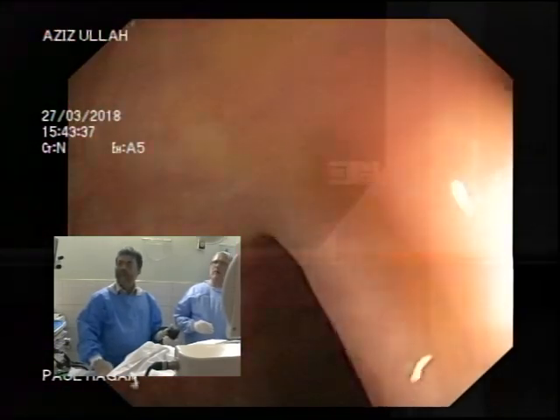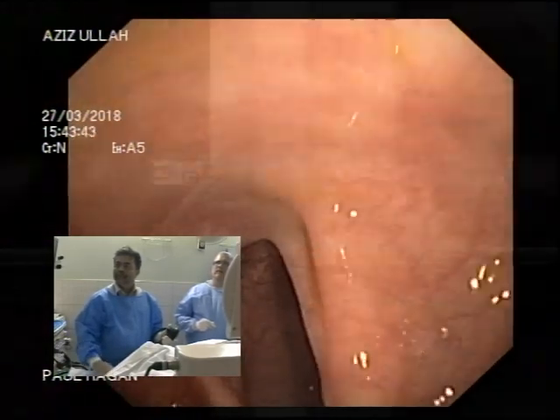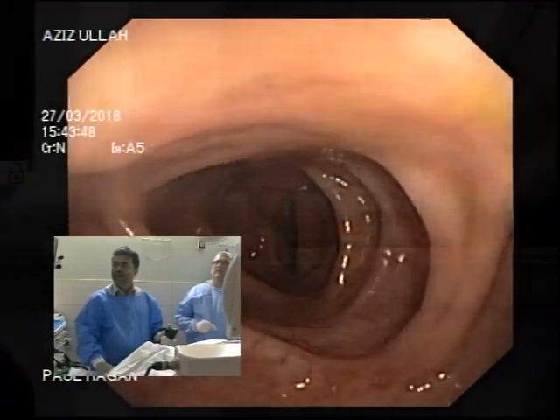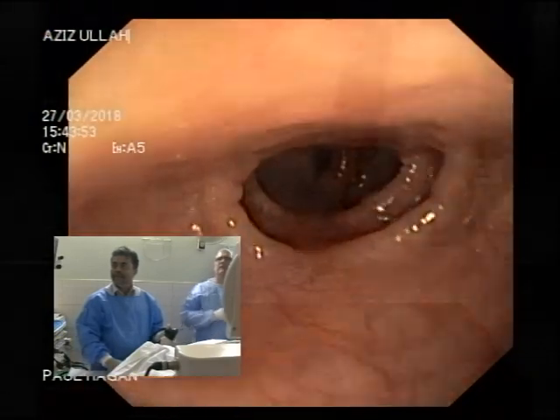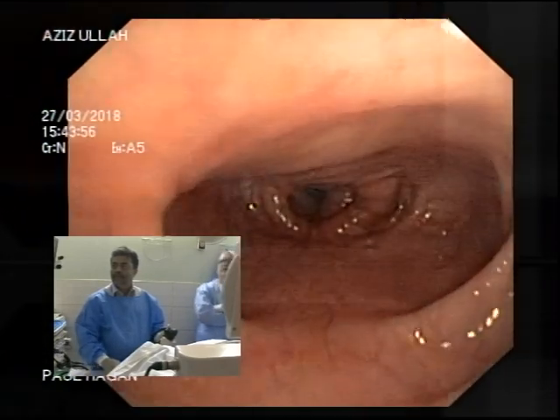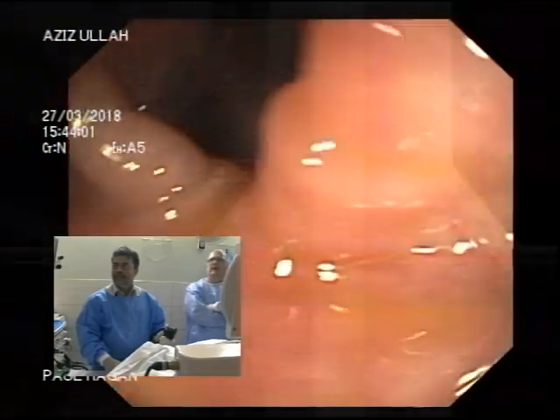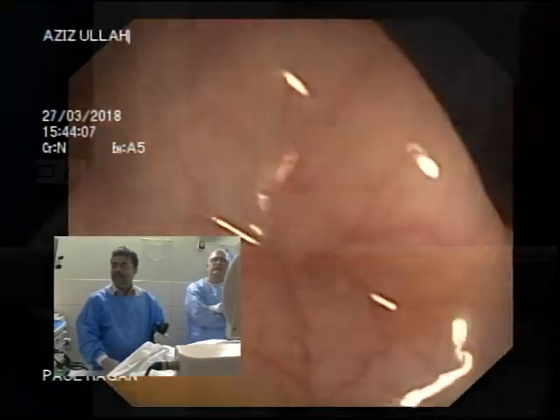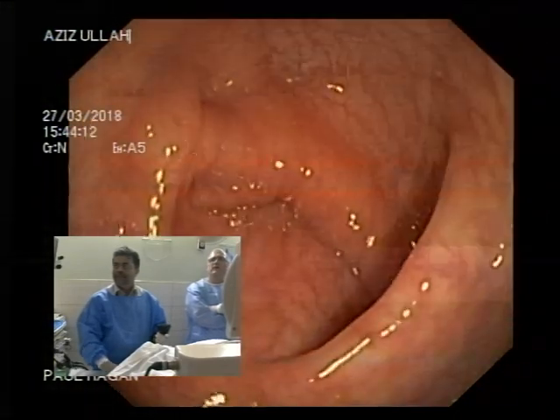You don't need to put your right hand on the scope. Now go forward. Go on. Slowly advance. Keep going. Slowly advance. Keep going. Great stuff. Keep going. Stop. Draw back 2 centimetres.